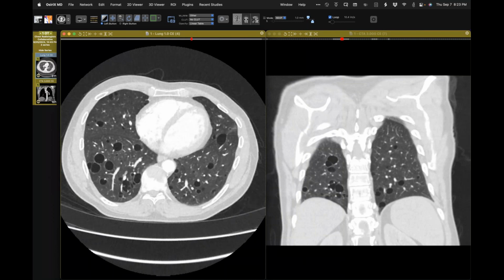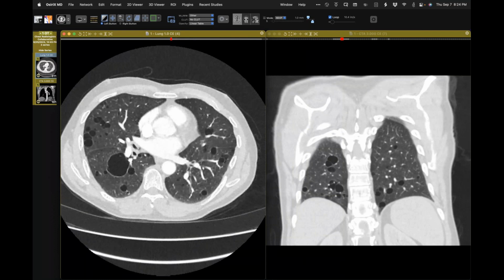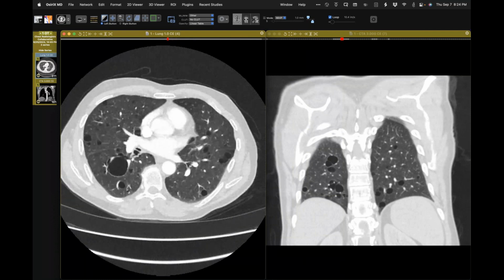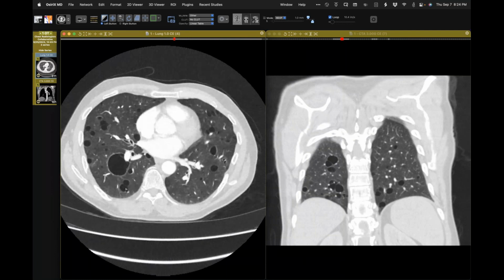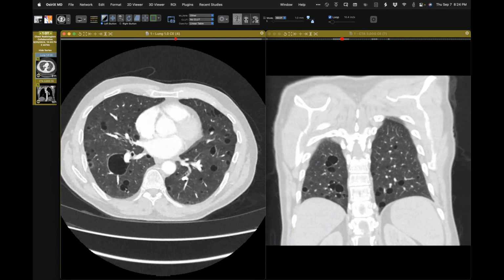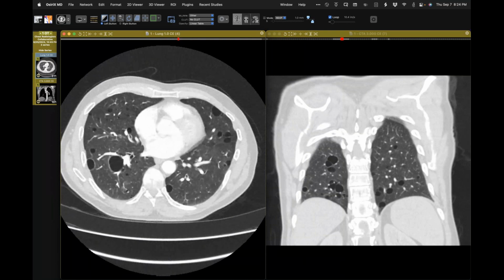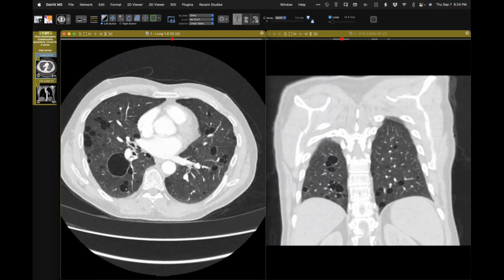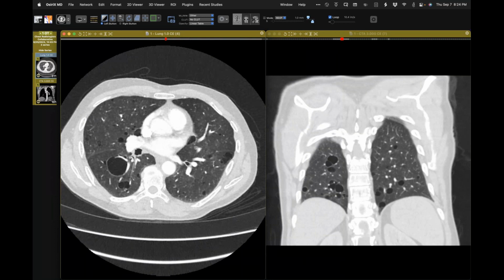So my reply was, these cysts are not those of PLCH. And by virtue of what I see and have described, two things come to my mind. First, Birt-Hogg-Dubé, and the second would be the cysts that may be consequent on the parenchymal deposition of immunoglobulin light chains or amyloid. What do you guys think about this case in general? Any other thoughts, like the so-called radiologic LIP, or like you said, the protein deposition case?